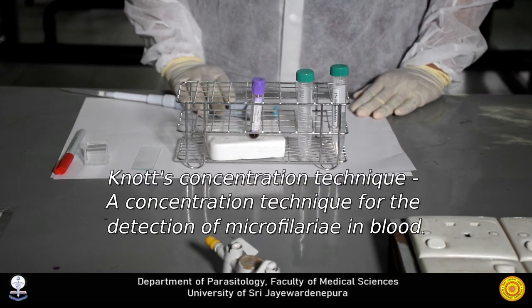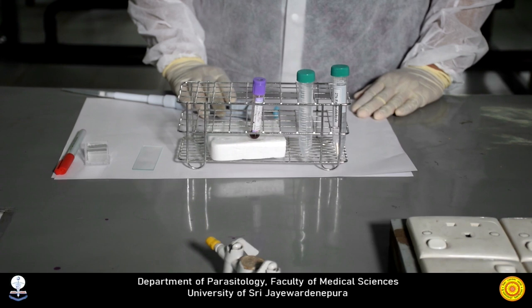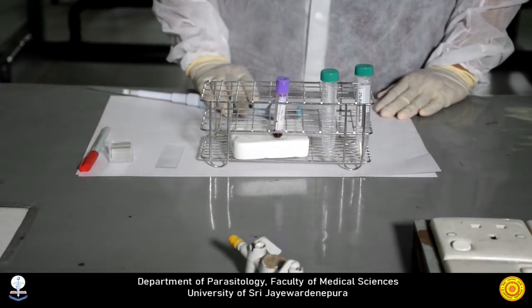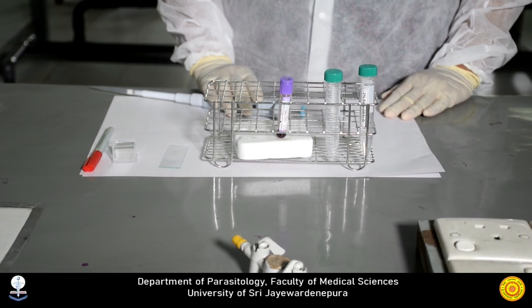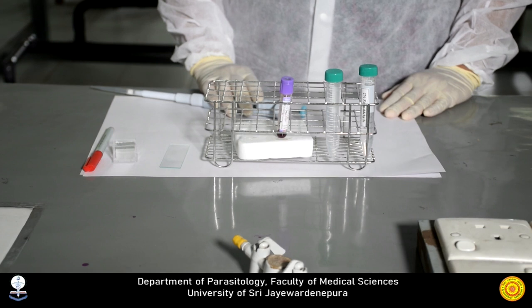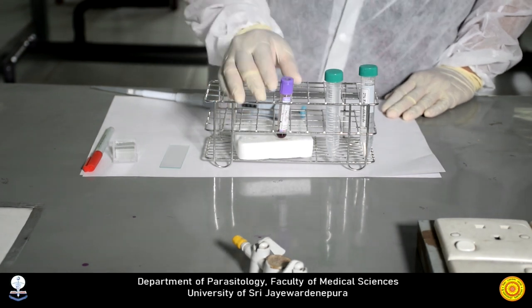Now we are going to demonstrate another concentration method for the detection of microfilaria in blood. This concentration method increases the sensitivity of the test. Here we are going to use anticoagulated venous blood.